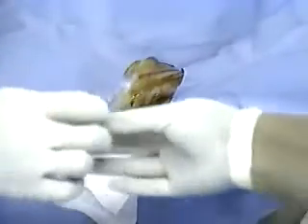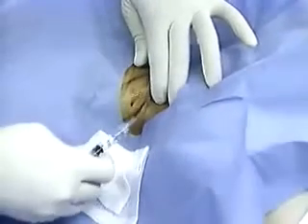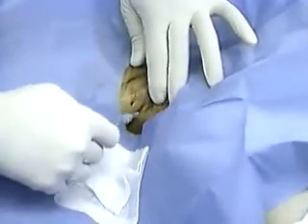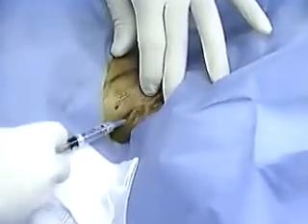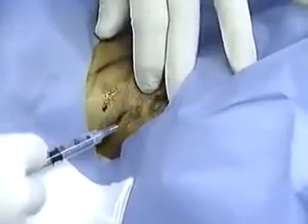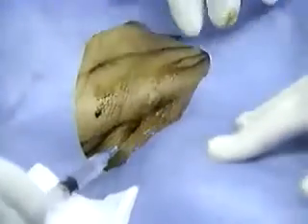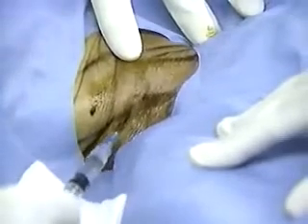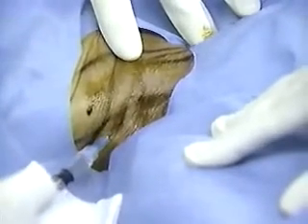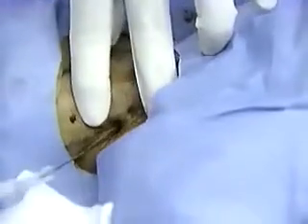Palpate the posterior head of the sternocleidomastoid muscle and inject a superficial wheal of lidocaine. Then inject lidocaine more deeply along the path you plan to follow with the introducer needle. This entrance spot may be identified just posterior to where the external jugular vein crosses the sternocleidomastoid muscle, or by selecting the midpoint of the muscle.